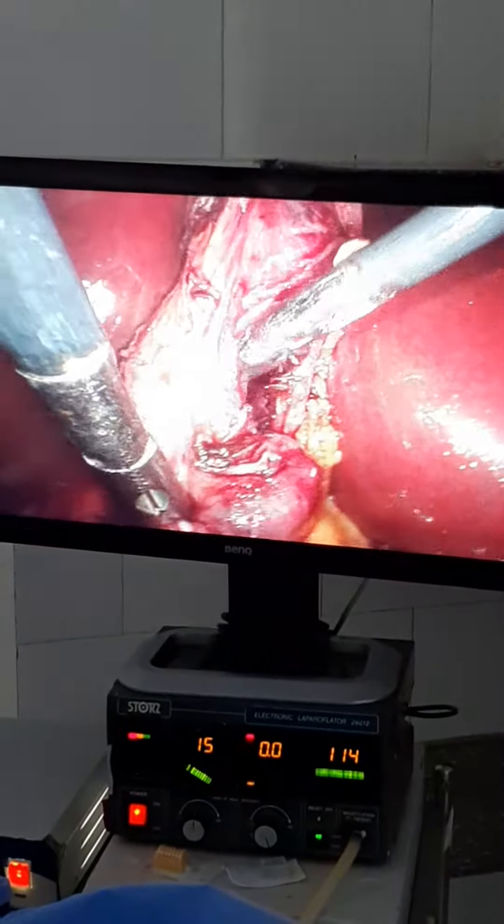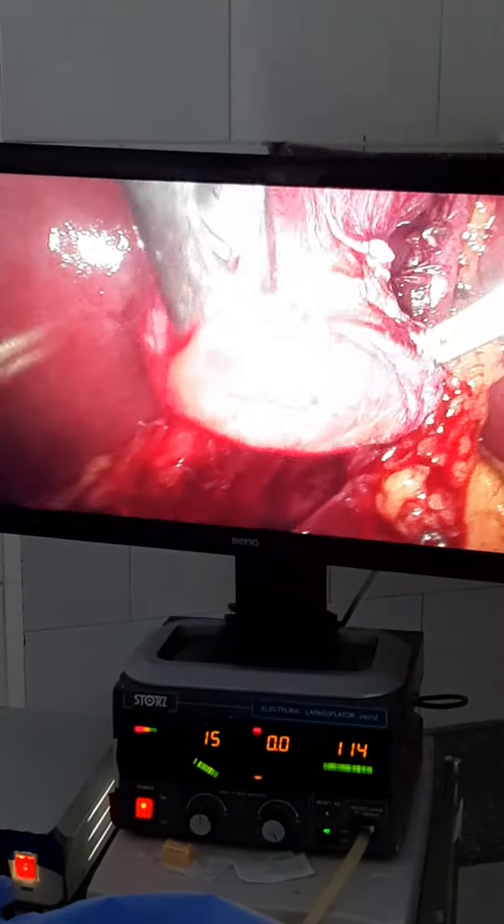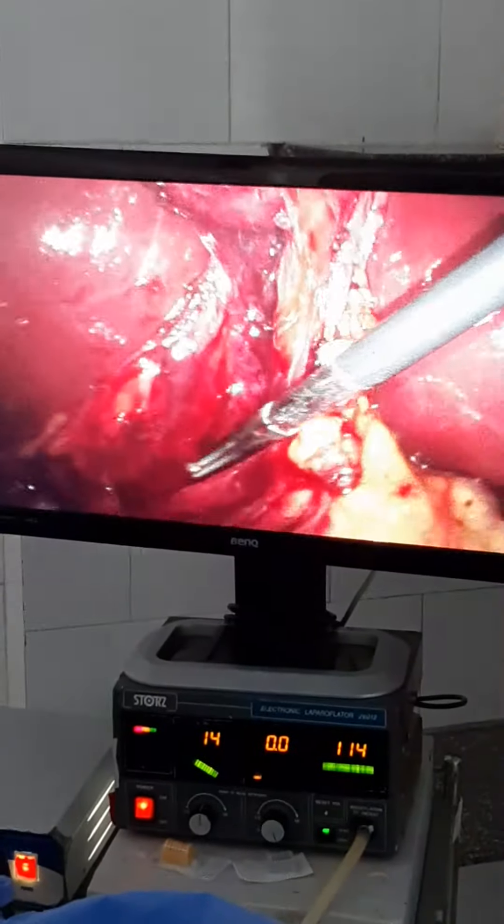So we expected that this is the end of the gallbladder, but we had dissected the Calot's triangle properly here. We found that Hartmann's pouch was twisted here and is stuck to the CBD. We dissected properly the Hartmann's pouch from its fossa here.